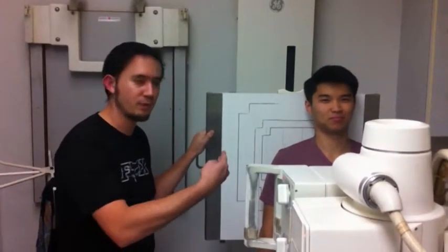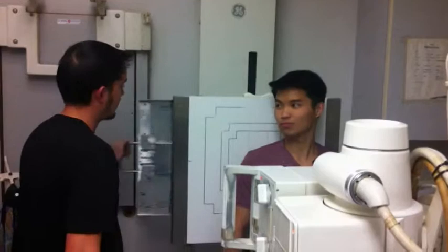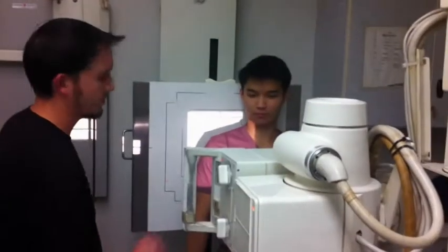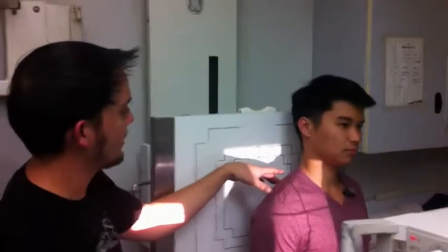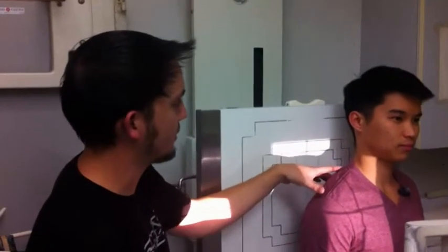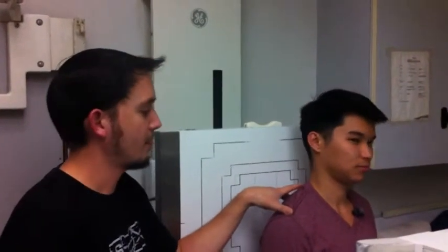So now we're going to be doing the Y view. We want to see the scapula in a lateral. In order to do this, we want to make an imaginary line. So we want to look for the AC area, right here somewhere, and then put your other finger on the medial border of the scapula.